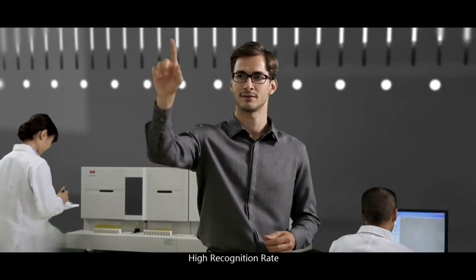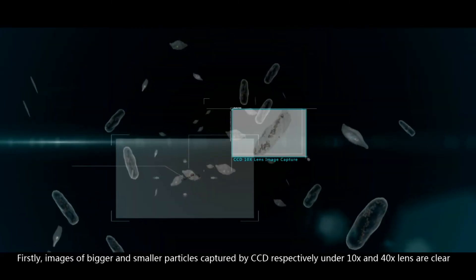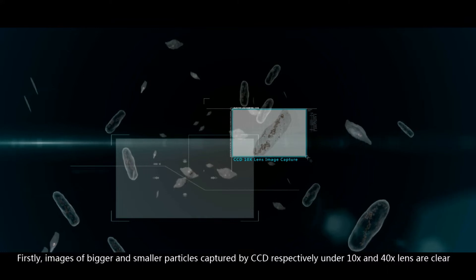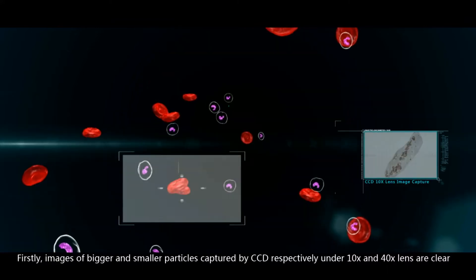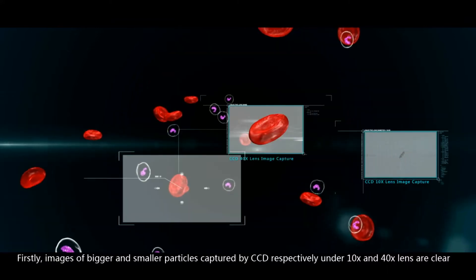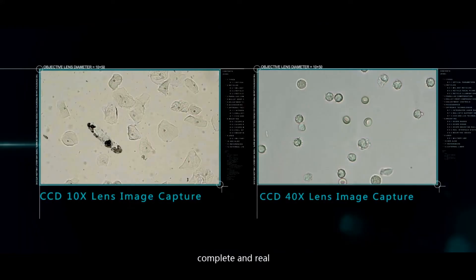High recognition rate. Firstly, images of bigger and smaller particles, captured by CCD respectively, under 10x and 40x lens, are clear, complete, and real. This assures the high recognition rate.